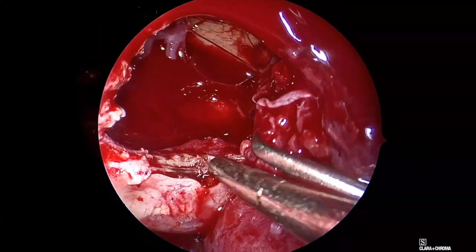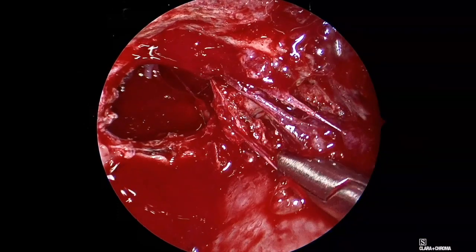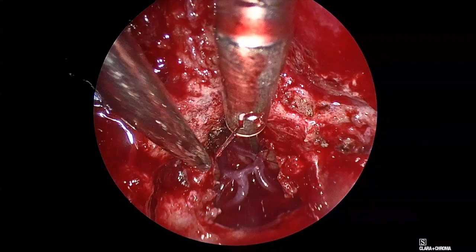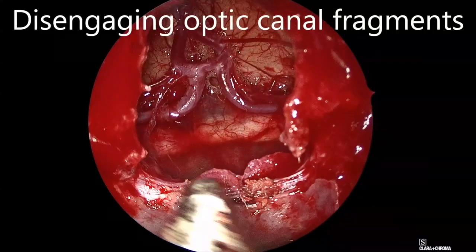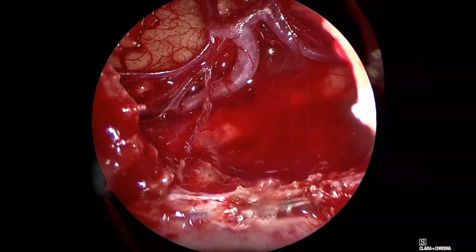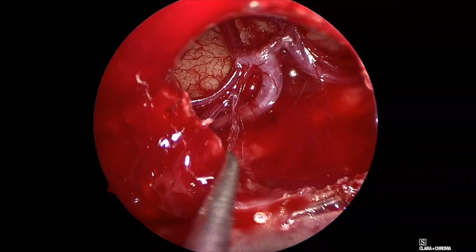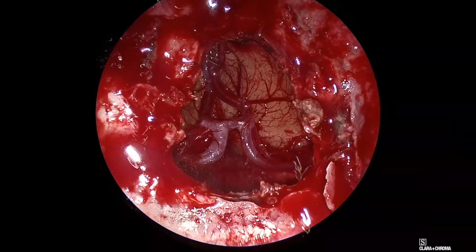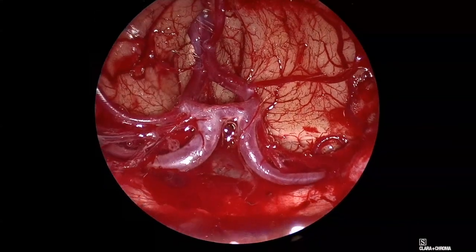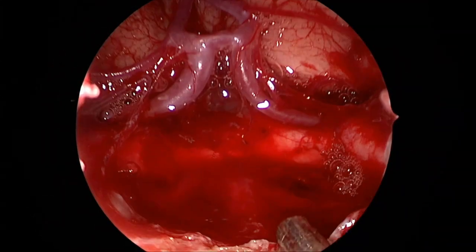The last remaining attachment to the lateral tuberculum dura was separated carefully, leaving no residue. The dural attachment was coagulated anterolaterally. Tumors in both optic canals were scooped out using angled visualization. In the end, both optic nerves, optic chiasm, anterior circulation vessels, and pituitary stalk were seen clearly. ICG angiography revealed intact subchiasmatic and hypophyseal vessels.